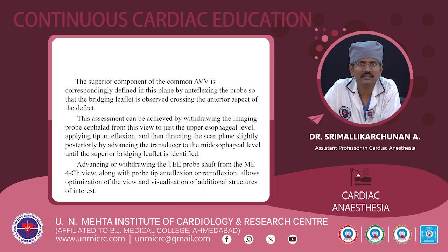Advancing or withdrawing the TE probe shaft from the mid-esophageal four-chamber view, along with probe tip antiflexion or retroflexion, allows optimization of the view and visualization of additional structures of interest.